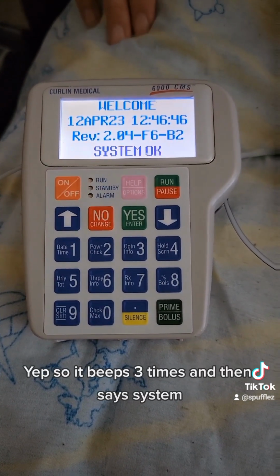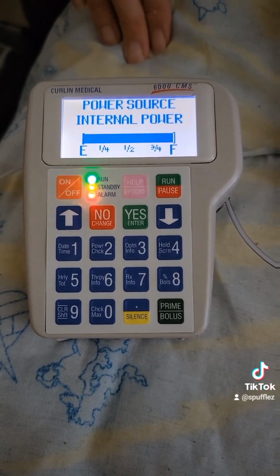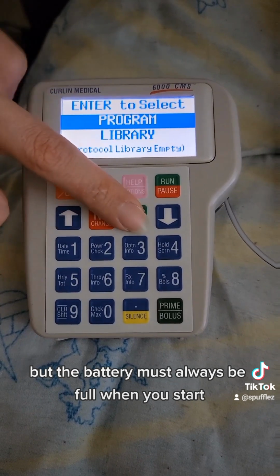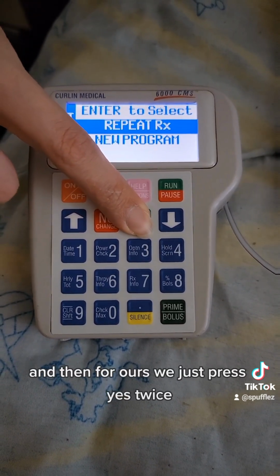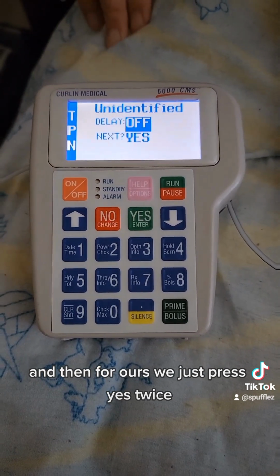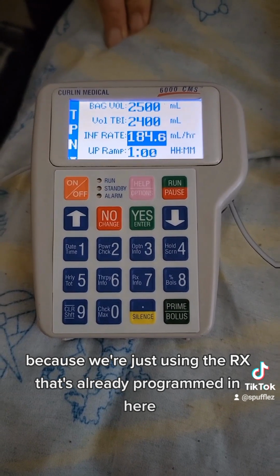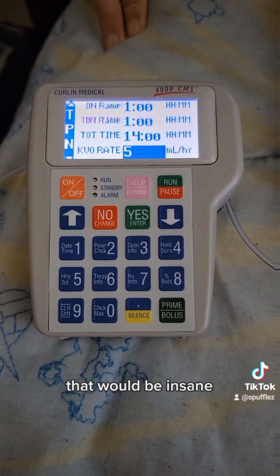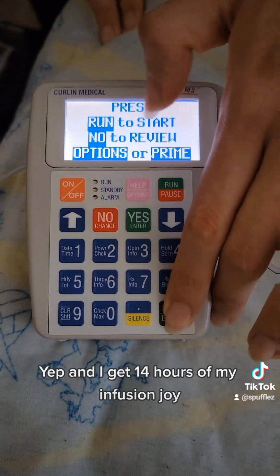It beeps three times and then says system okay. You gotta check to see if the battery is full. Not all machines might be the same, but the battery must always be full when you start. And then for ours, we just press yes twice because we're just using the RX that's already programmed in here. Don't worry, they're not going to make you write your own pump program. That would be insane. And I get 14 hours of my infusion.